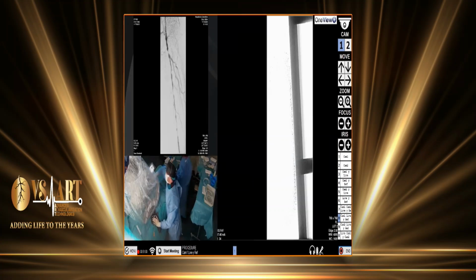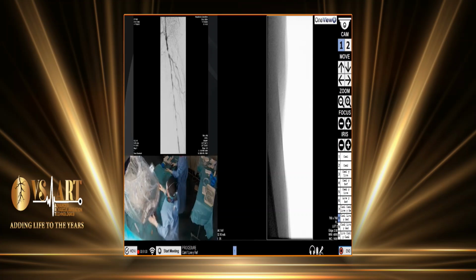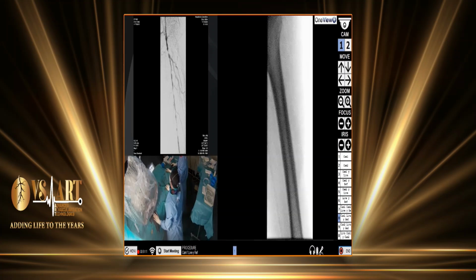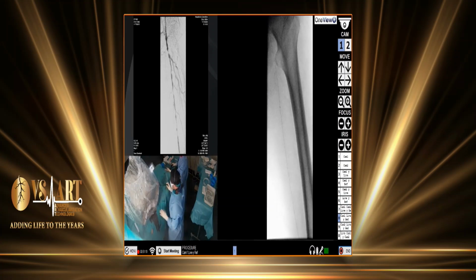Nobody here? No. I mean, we've used it before, but the lacking thing is the long-term outcomes for shockwave. Yeah, all the published data is just the acute procedural outcomes, nothing more than 30 days. I fully agree, and for that reason, this is still the gold standard, the endarterectomy. It always happens that a new device needs time to get evidence, and we'll see if we have good evidence in the future. But I fully agree.